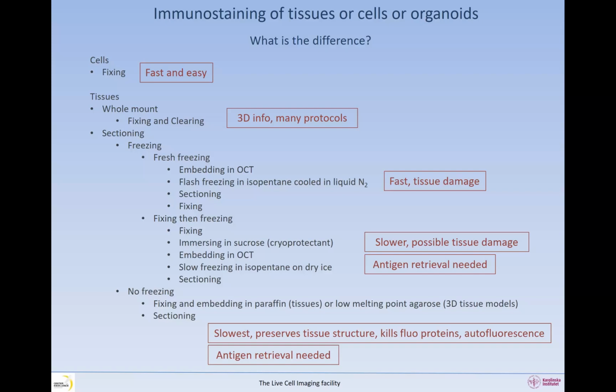So they are quite harsh for the tissue, and quite often also will lead to the tissue detaching or being destroyed. So now we have an idea a little bit of what's the difference when we are working with cells or when we are working with tissue.